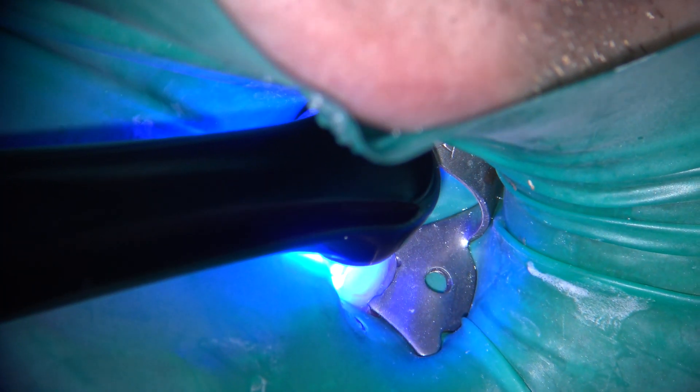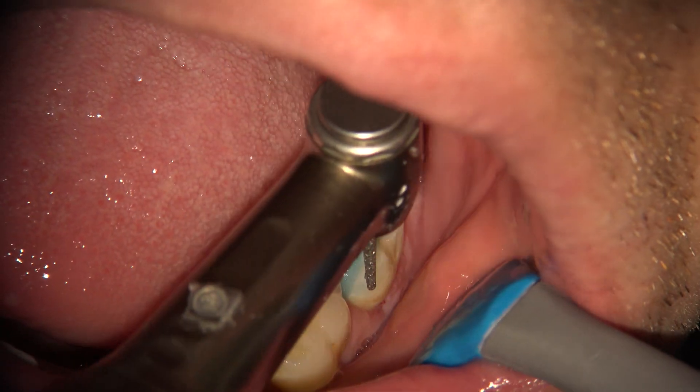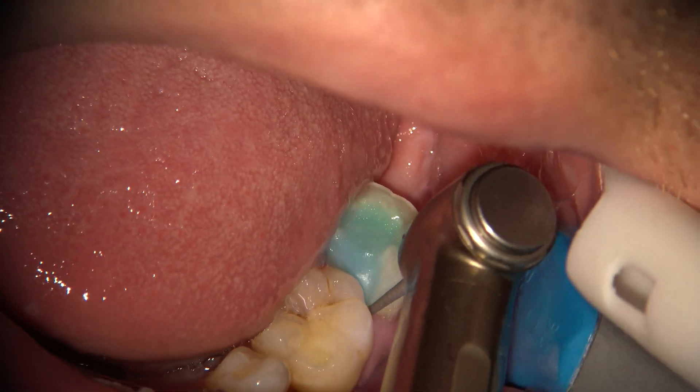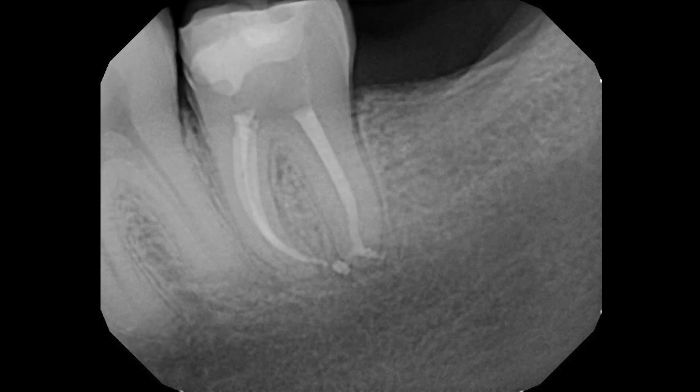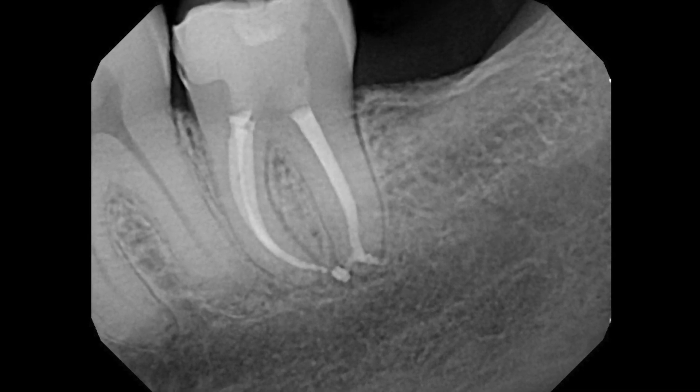What's nice when using a bonding agent is you can avoid needing a matrix band, because you can create and bond using your light. When you use a bonding agent, you need to wait 35 to 40 seconds for etching and bonding before light curing. We used the rubber dam here as the matrix band. Since it's going to get a crown, you don't need precision for your contacts. And on the distal, we did get that bifurcation filled — there's that little division at the apex. The curve is filled very nicely.